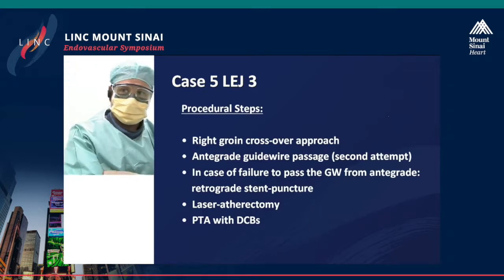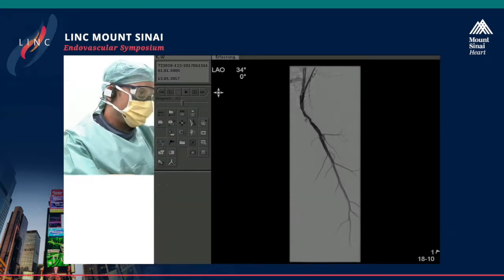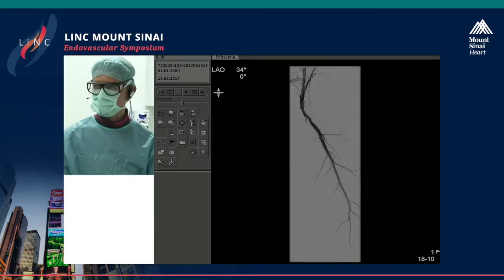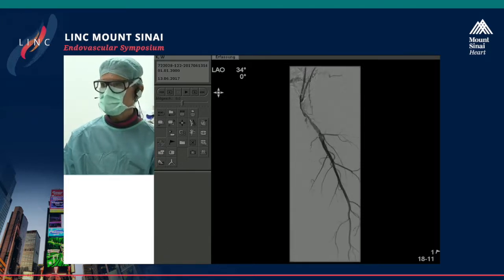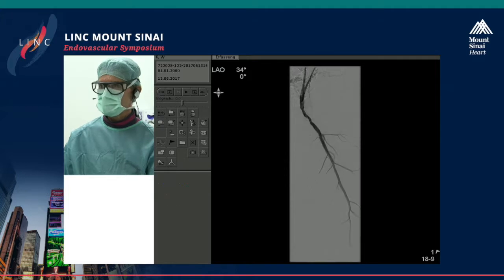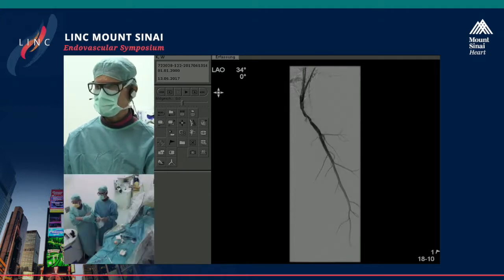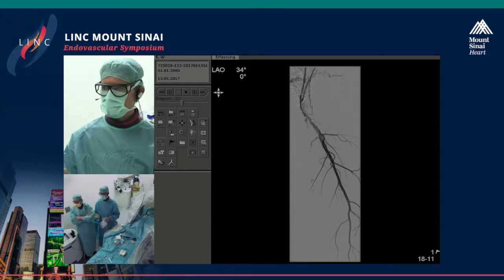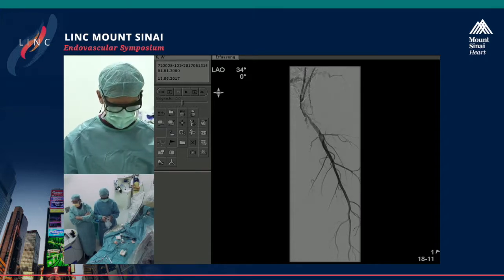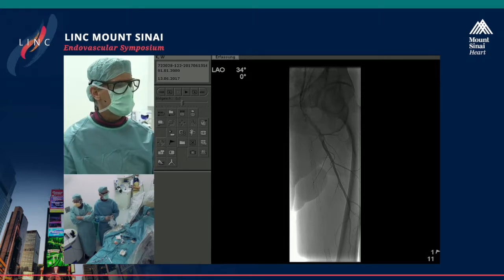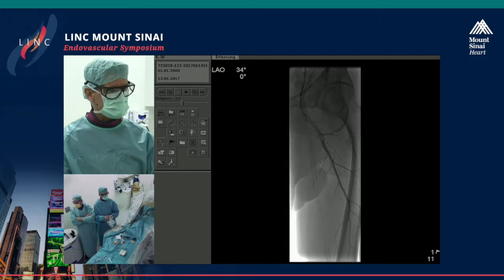We worked a little bit on that lesion already. Here you can see the angiography — the profunda artery is also not the strongest one. You can see a little bit of contrast going into the occlusion. As you heard, there was a previous attempt and there were problems to get the wire into the stent. You can see the traces of that attempt — three centimeters proximal to the stent is occluded.